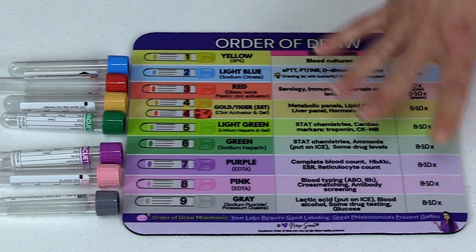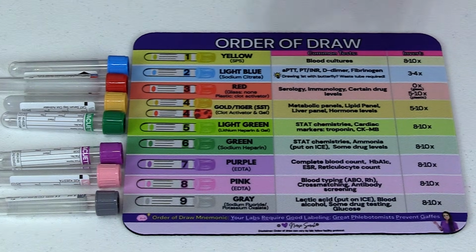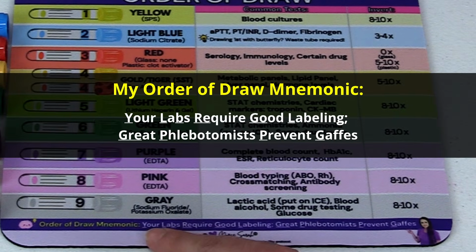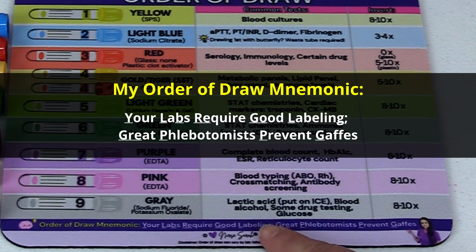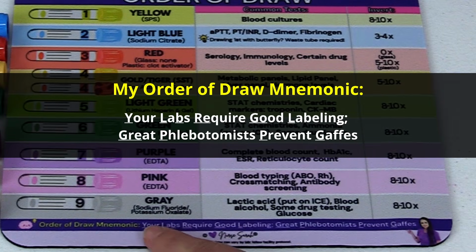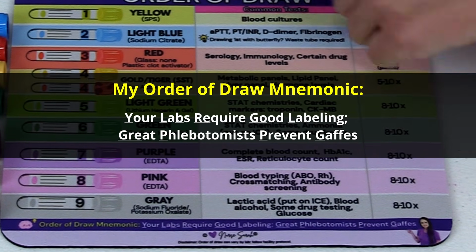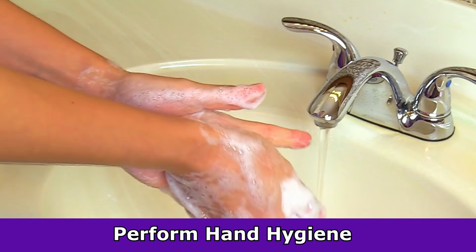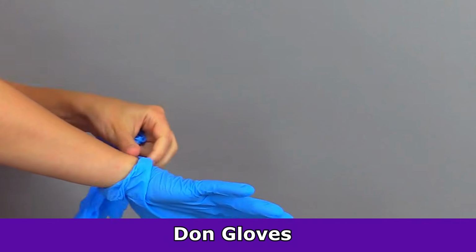Now, how can you remember the order of draw? Well, here's a mnemonic I created to hopefully help you. It says, your labs require good labeling, great phlebotomists prevent gaffes. So the first letter of the mnemonic will correlate with the colors. And then after you've collected all of your supplies, you want to perform hand hygiene and don PPE.